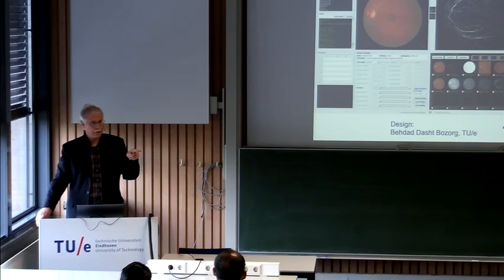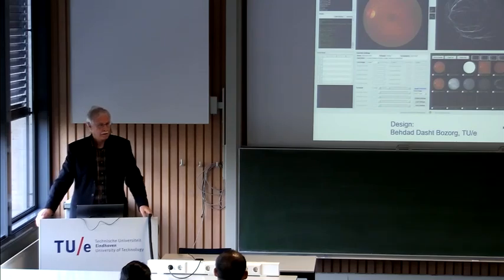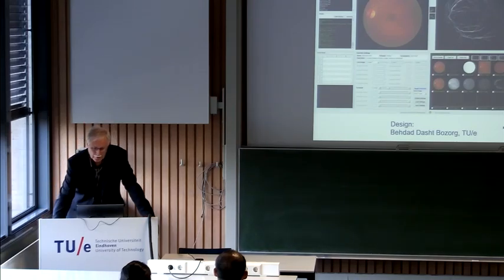And this is important for follow-up of these patients. They start to change their lifestyle. They start to take medicine. Sometimes they get treatment. You have laser treatment. If the leakage is too bad, you can just close these vessels. And then you can have longitudinal studies and see, are my parameters deteriorating or getting better, or are they stable?